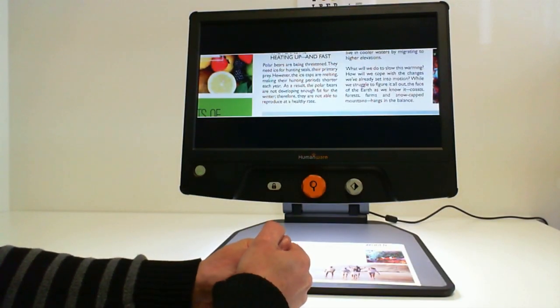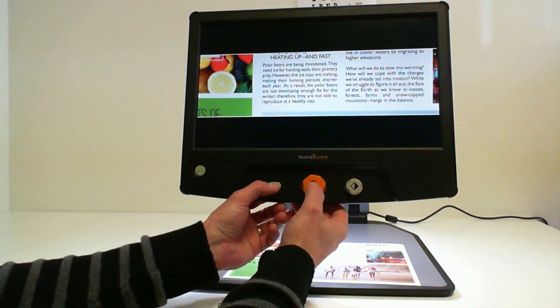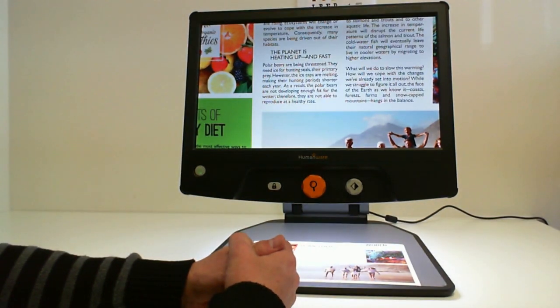These lines or blinds are there temporarily. If you turn off and turn back on the device, these displays will be turned off or disabled. If you do the shortcut a third time, the blinds will disappear and you're back to home base.